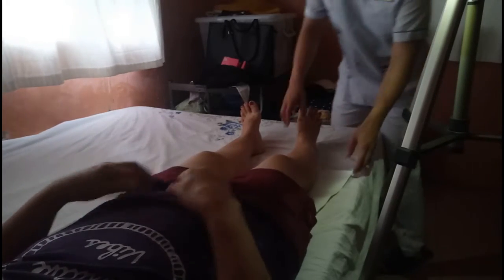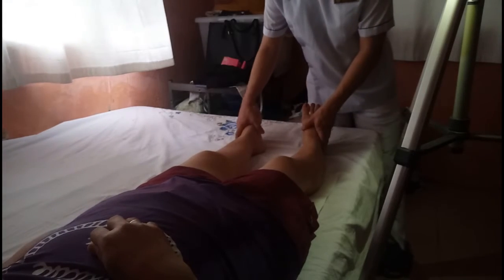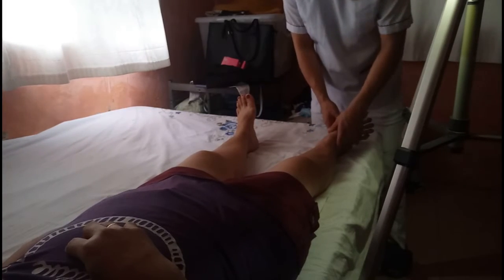Since the patient cannot assume a mediolateral projection, we're going to move into an AP oblique projection, lateral rotation. Place the patient on the radiographic table in the supine position and support the ankles. Position of part. If necessary, elevate the hip of the unaffected side enough to rotate the affected limb. Support the elevated hip and the knee of the unaffected side.